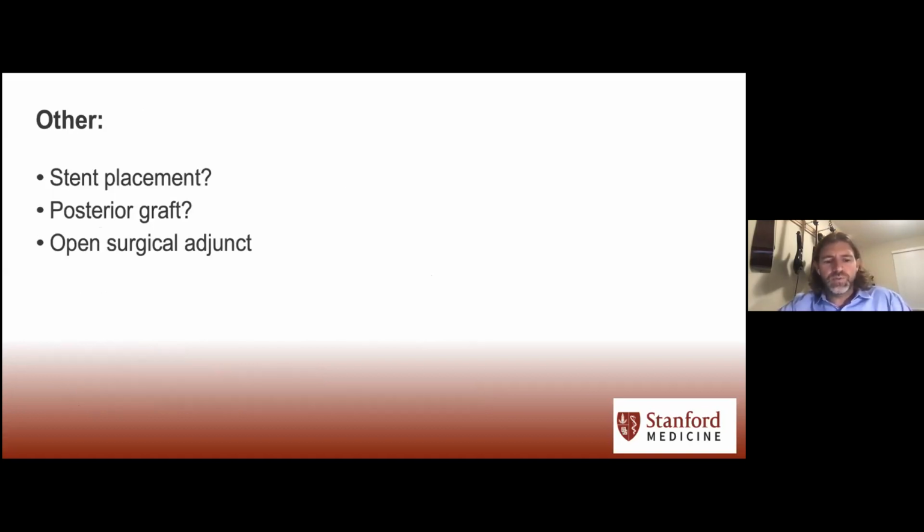So the other things that we tend to see with balloons are stent placement. I didn't want to expand too much on stent placement because that could be another 30 minutes of talking, but placing stents in very specific locations like Palmaz stents, where the stent comes wrapped and sheathed over a balloon, you actually can place that in the bronchus, for instance. We placed a couple last week.